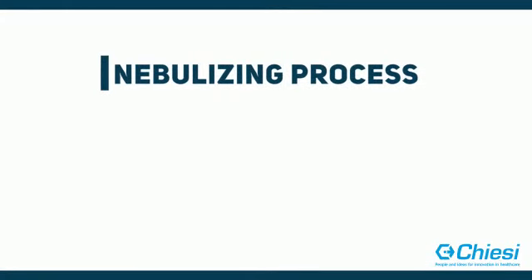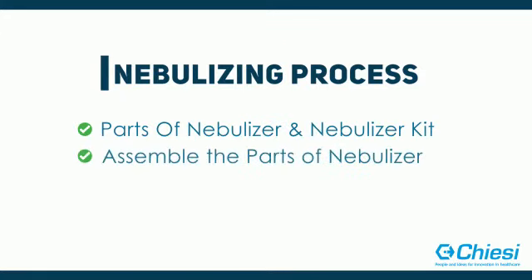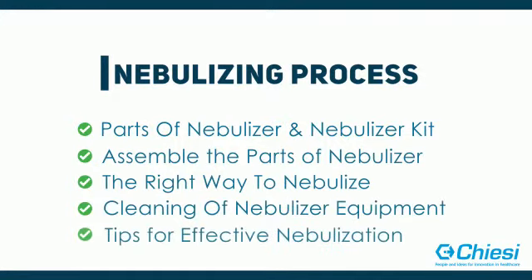Now we will discuss the steps of the nebulizing process: parts of the nebulizer and nebulizer kit, assembling the parts of the nebulizer, the right way to nebulize, cleaning of nebulizer equipment, and tips for effective nebulization.